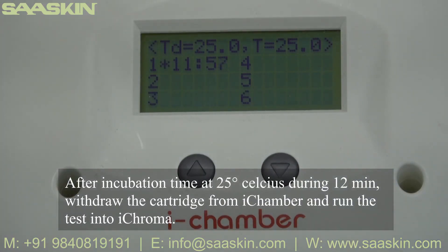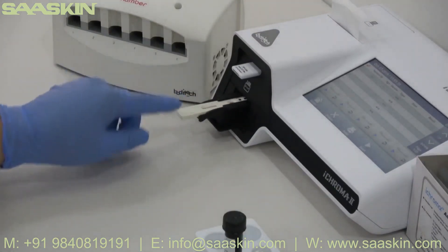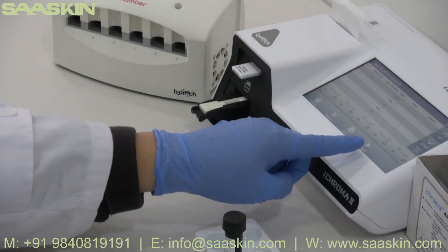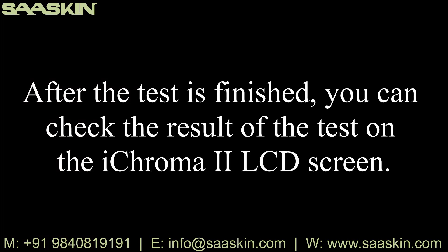Insert the cartridge into the i-Chamber for an incubation time of 12 minutes at 25 degrees Celsius. Withdraw the cartridge from the i-Chamber and run the test in the i-Chroma reader. After the test is finished, you can check the result.